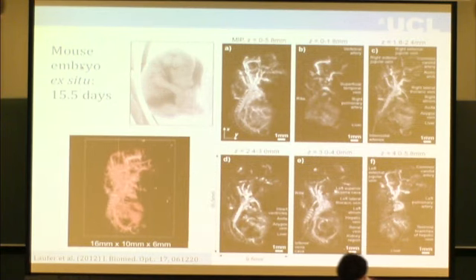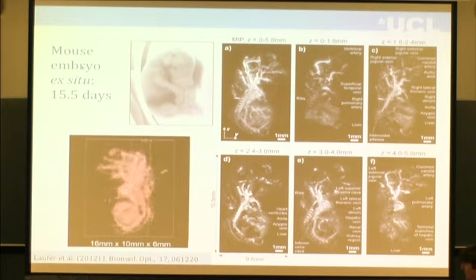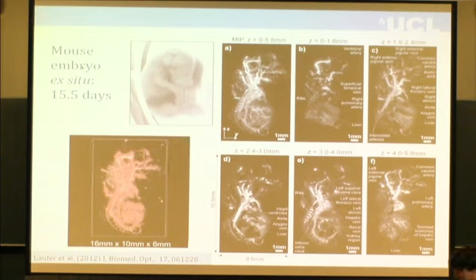There we go. This is a mouse embryo. This one's actually outside the womb, but you can take these through the wall of the womb, so you can take them in utero. And you can see lots of details that I don't know what they are, but they're useful to the people studying the embryology. Now these images look quite good.